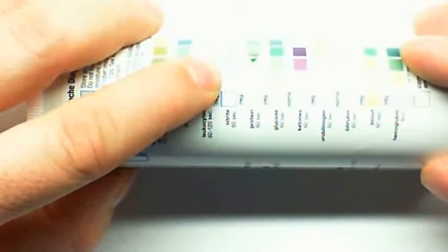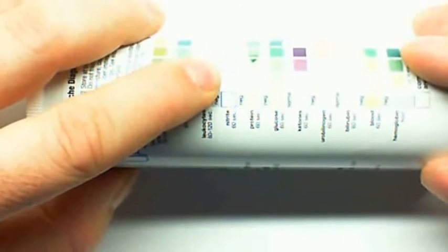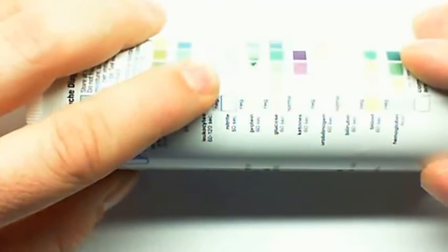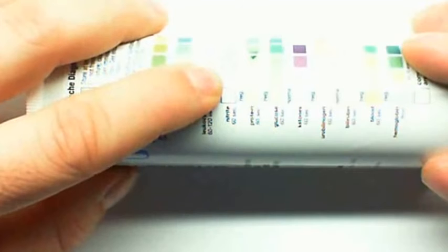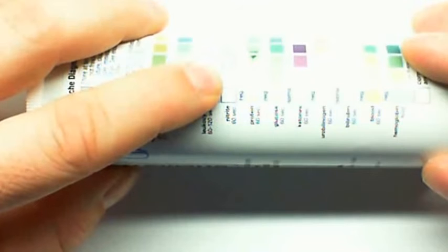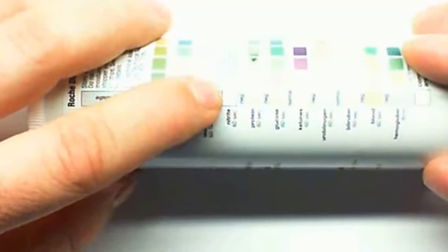The next step down is nitrite. Any kind of pink color is an indication of nitrites. Nitrates are usually in the urine, and certain bacteria will convert nitrates to nitrites. That's really the only way you can get nitrites in your urine. So if there's nitrites in your urine, it's an indication that there's bacterial infection, or that there's bacteria in the urine. Specific bacteria would be like E. coli, Salmonella, Citrobacter, Proteus, and Klebsiella. Those are the types of bacteria that convert nitrate to nitrite. So if you have nitrite, it indicates a urinary tract infection.